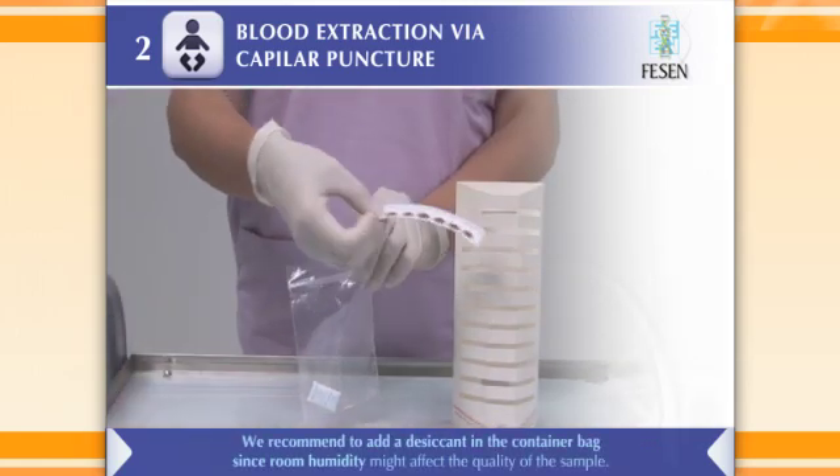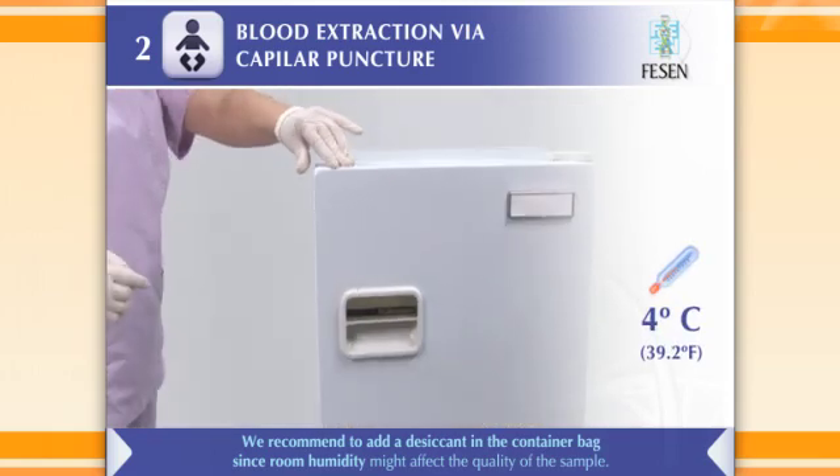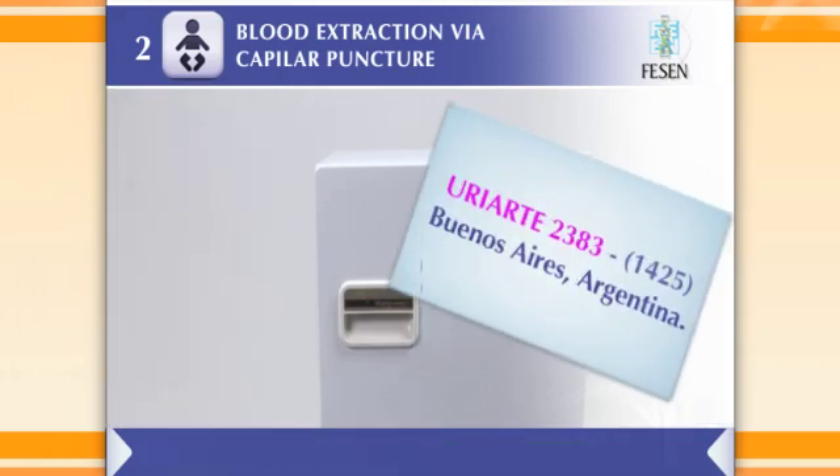After correctly drying the filter paper, put it in a zipper sealed plastic bag in the fridge at four degrees centigrade for storage until it is sent to the laboratory for analysis.